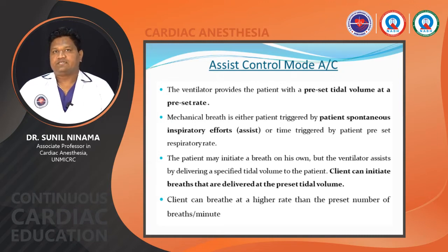The patient may initiate a breath on their own, but the ventilator assists by delivering a specific tidal volume to the patient. The client can initiate breaths that are delivered at a preset tidal volume, and the client can breathe at a higher rate than the preset number of breaths.